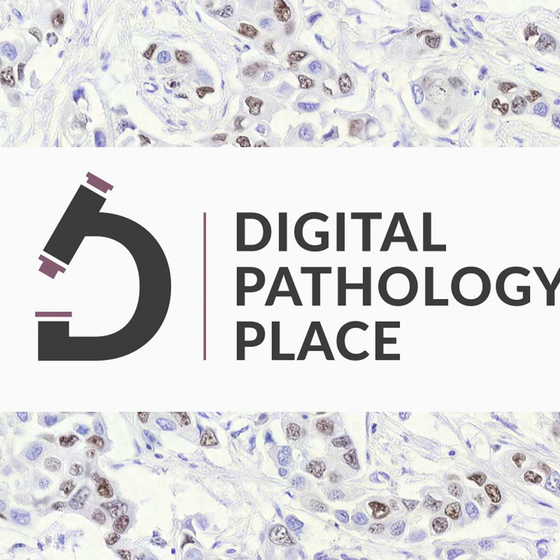And then the newest technology is actually using imaging mass cytometry, using time of flight cytometry, where they're able to, using heavy metals rather than chromogens or fluorochromes, monitor up to 60 biomarkers on the same piece of tissue at the same time. Each has its own advantages, each has its own limitations, and each comes at a different price point.